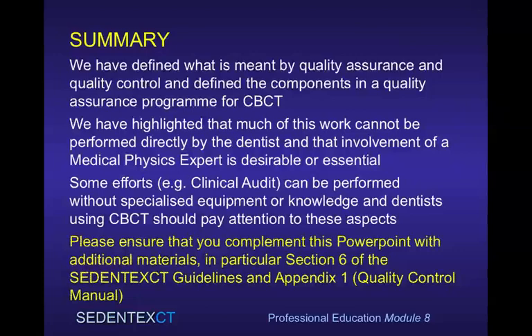Please ensure that you complement this PowerPoint with additional materials, in particular by reading Section 6 of the Sedentex CT Guidelines and Appendix 1, the Quality Control Manual within the guidelines.